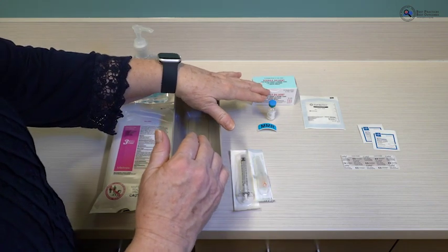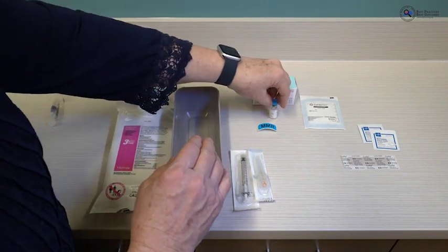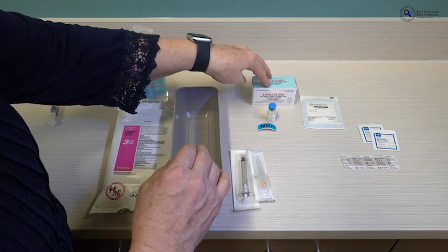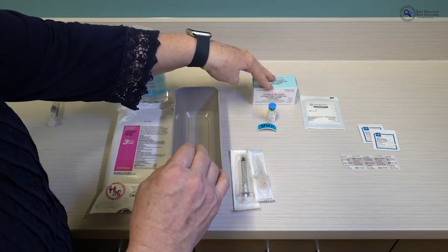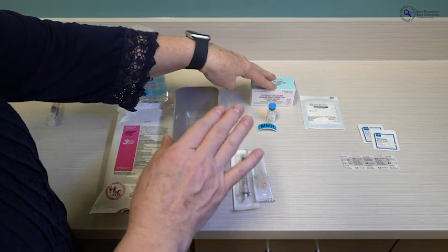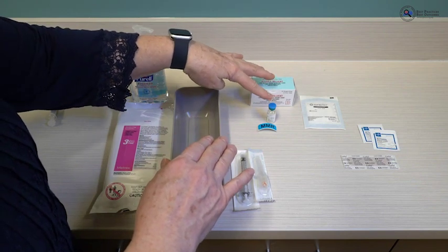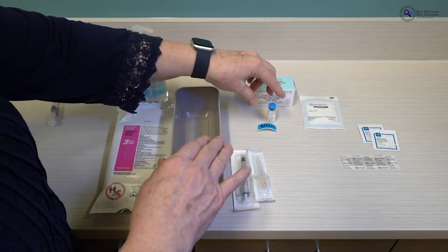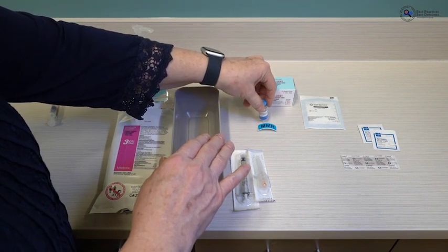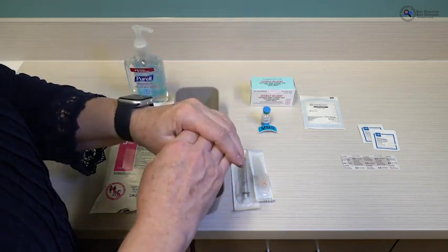For MMR vaccine, this is a vaccine that you will reconstitute. That means you will have the actual vaccine vial — it's a powder in the vial — and you will reconstitute it using the diluent provided by the company. The diluents are not interchangeable, so always make sure you have the right one. Neither the vaccine nor the diluent has a preservative. This vaccine is kept under very controlled temperatures because it's a live vaccine, so you must prepare and administer it very quickly.